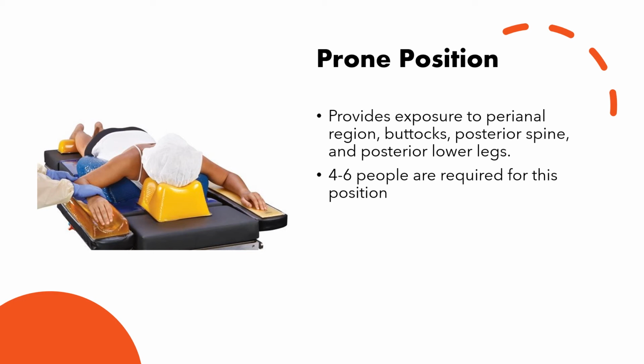And what is going to happen is the anesthesia care provider will put the patient to sleep, which is called induction. So they'll induce the patient on the gurney and go ahead and intubate and secure the tube. And then the team is going to log roll the patient over onto the OR table.